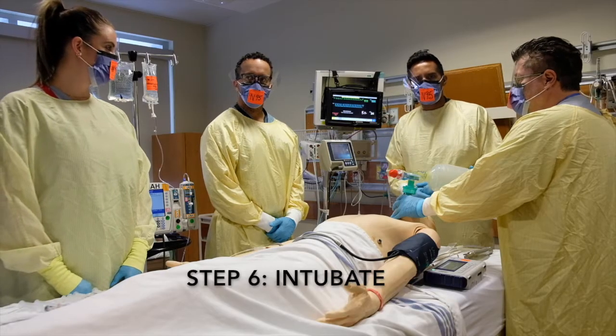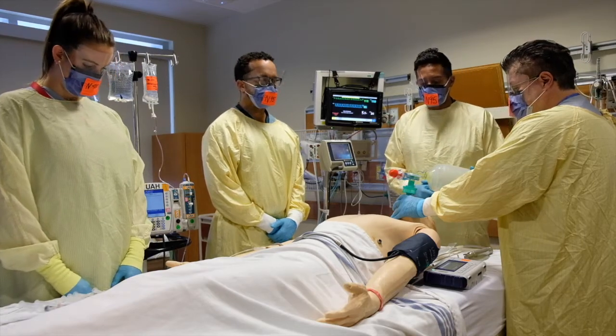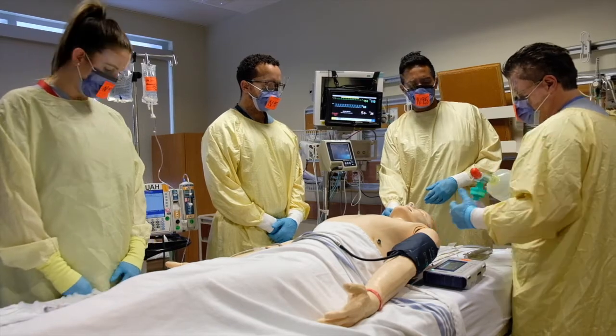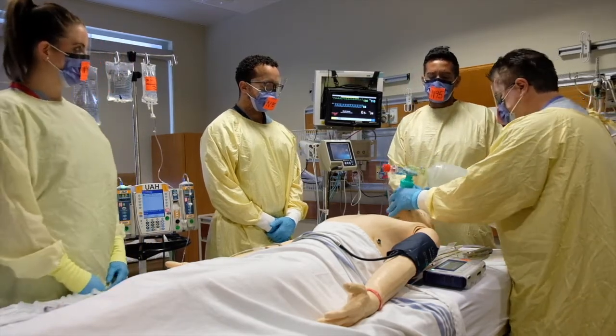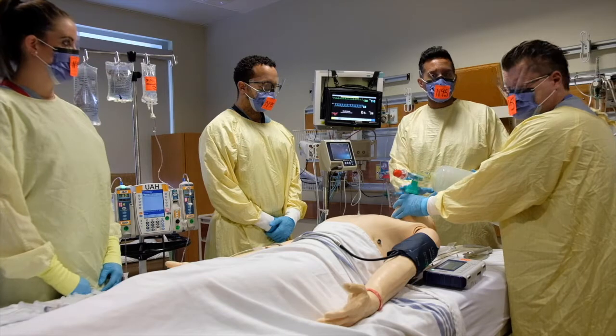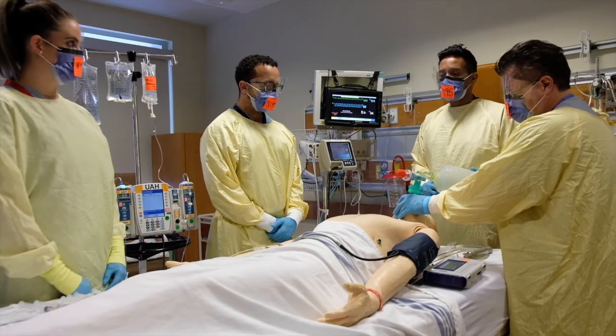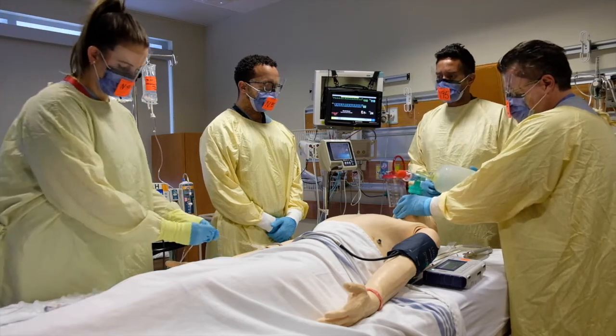So now that we've gone through our checklist and the patient is prepared, we'll continue with intubating. As you can see, the patient is on 15 liters via high-flow nasal cannula. And we've also put the bag valve mask on top with flush oxygen, but we're not bagging so that we do not aerosolize anything into the environment. We will then proceed with rapid sequence induction for this patient.